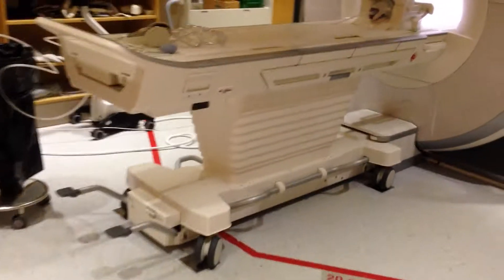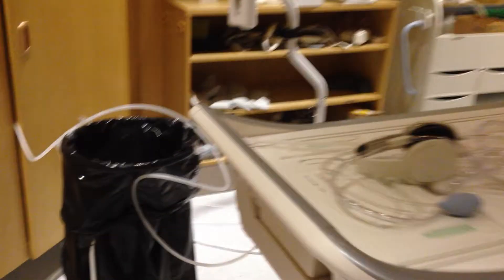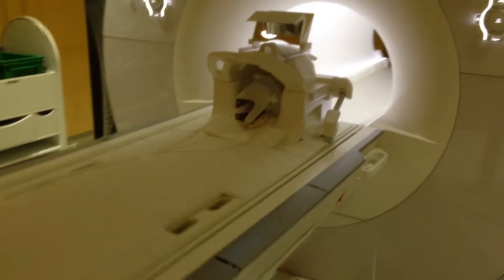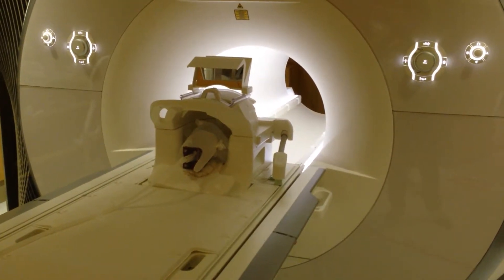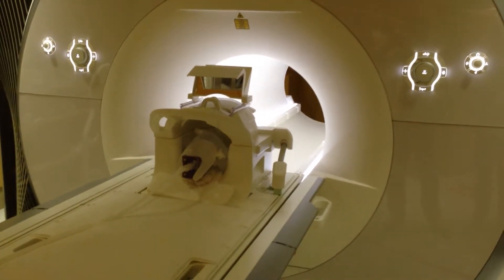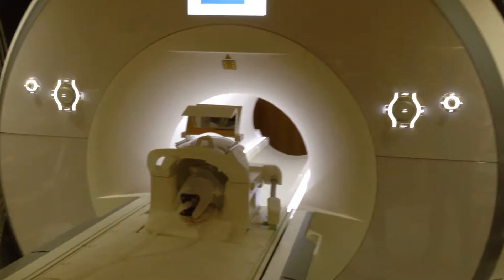And then in the MRI room, the flow comes into the model. And then the model is there actually inside of the little cage which is a head coil that helps improve the signal in the MRI. You can't see the model right now, but I have one here in my hand that's similar.